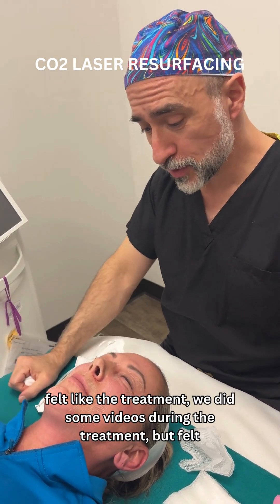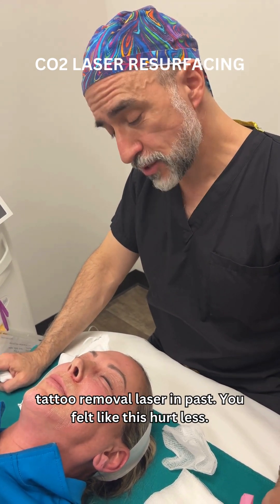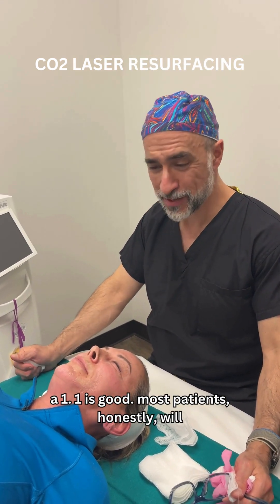And you felt like the treatment — we did some videos during the treatment — but you felt like it wasn't that bad? Not at all. Had a tattoo removal laser in the past, and you felt like this hurt less. Oh yes. Tattoo was a 10, this was a 1.